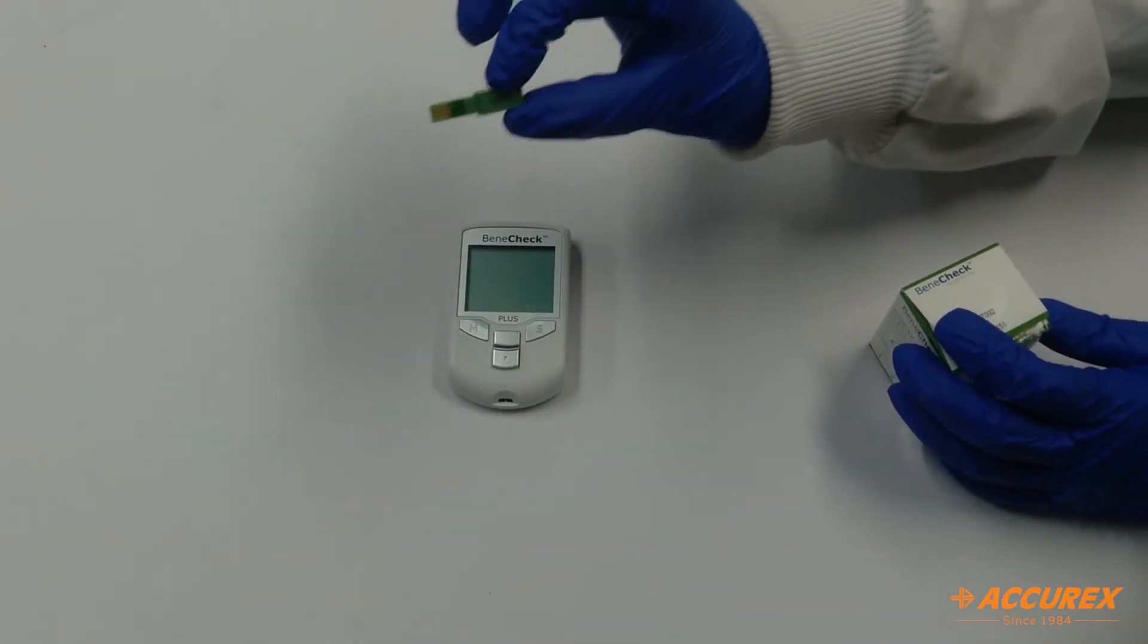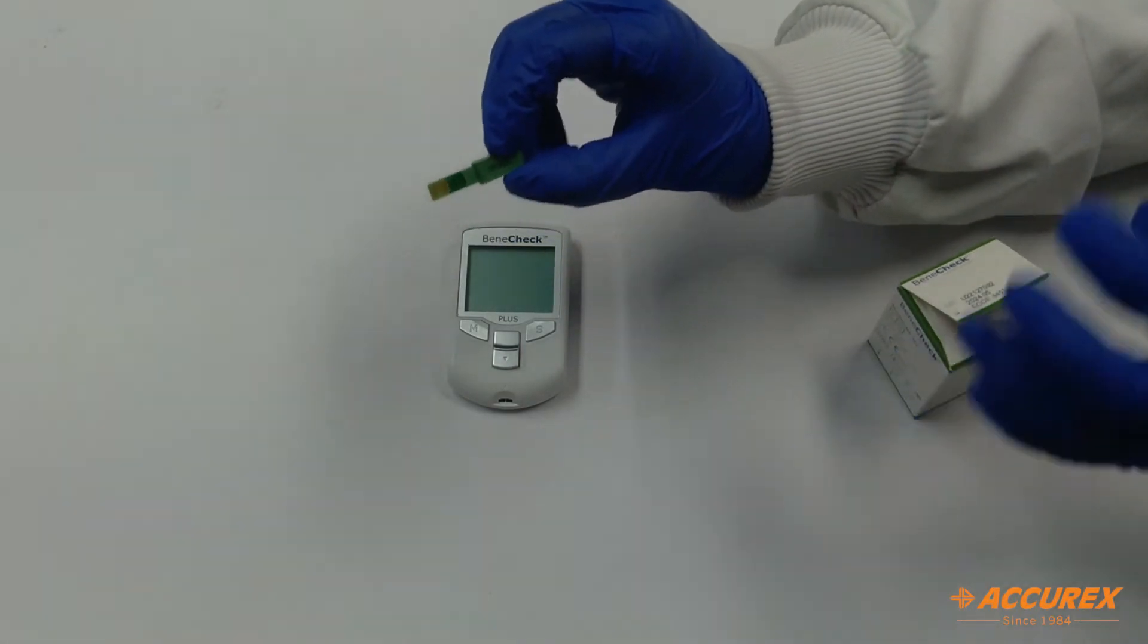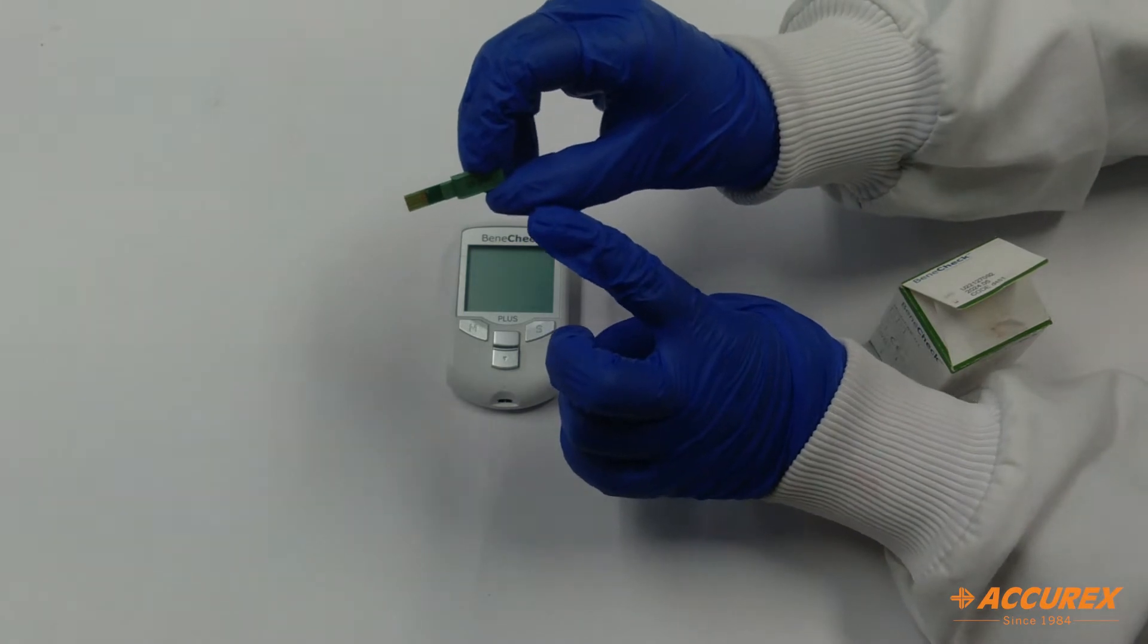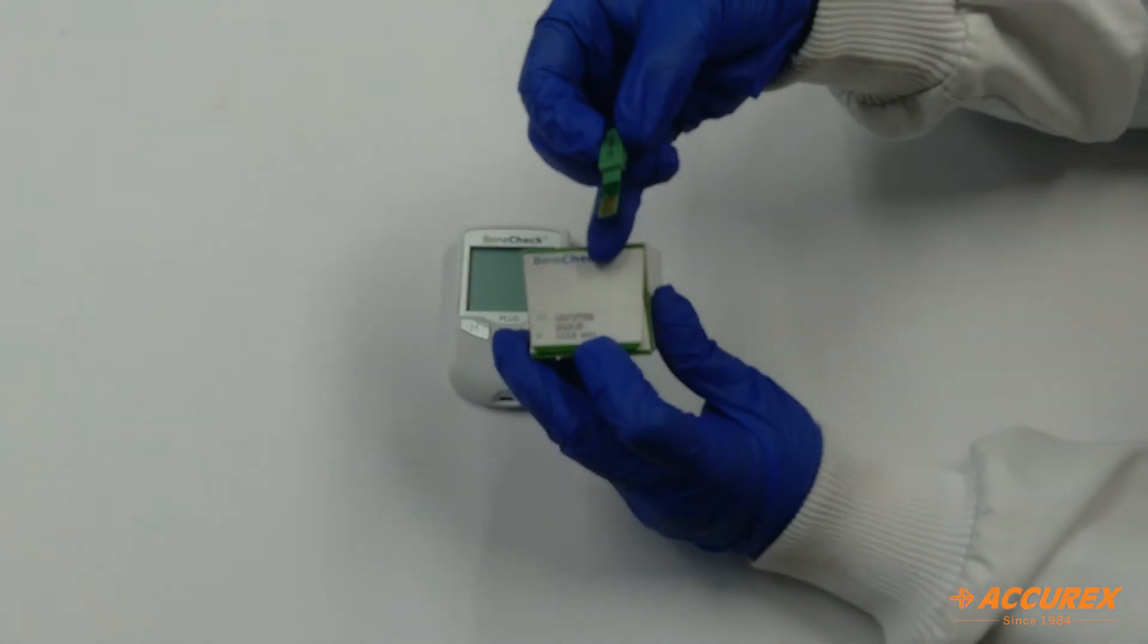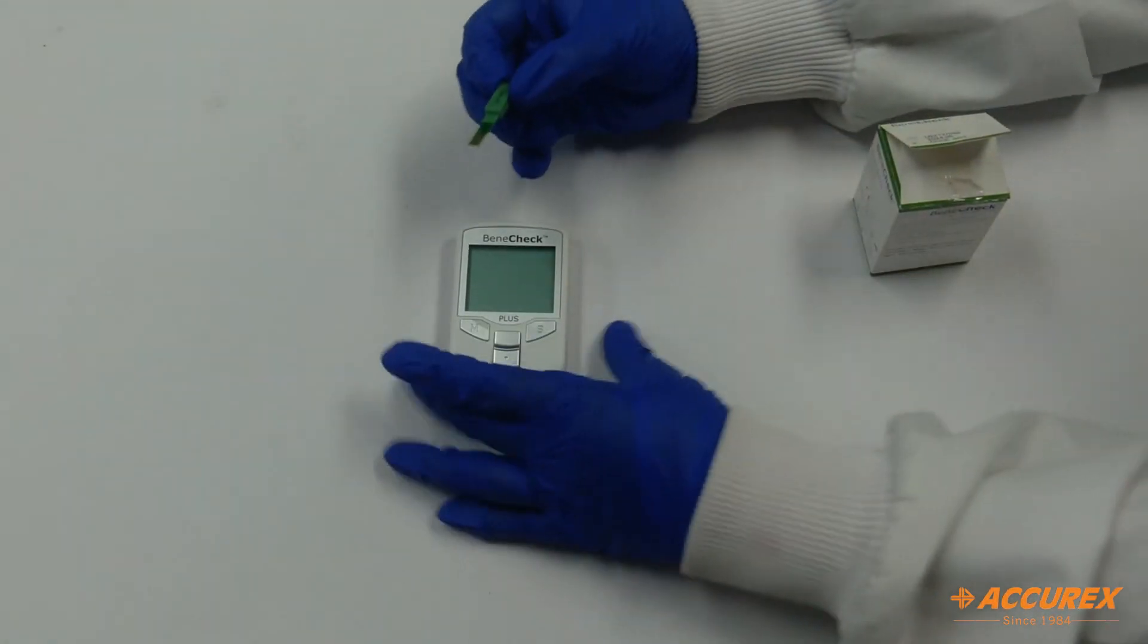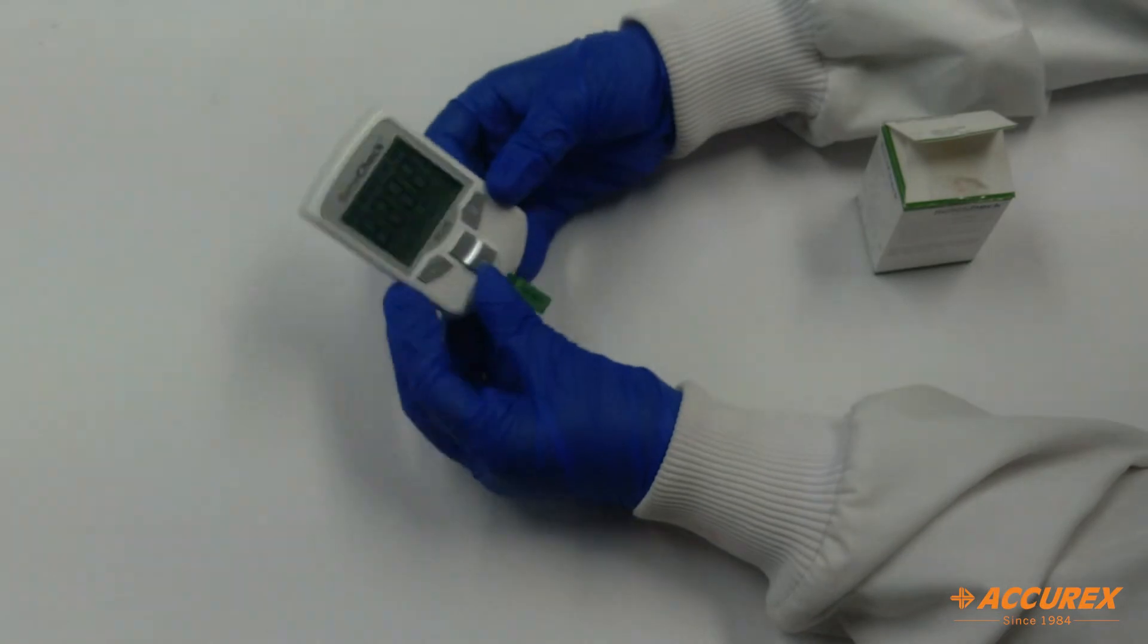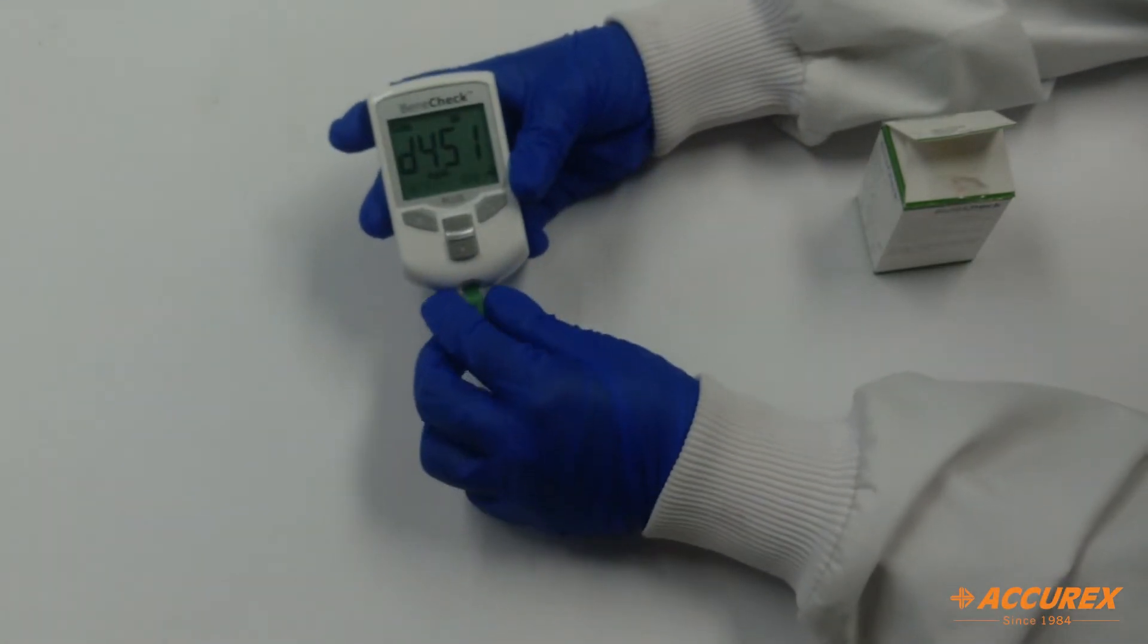First we need to insert this code chip. This code chip comes with the strips and the code number given over here, D451, should be equal to the code number given on this strip. For this code chip only this strip will work. We will insert the code chip in this meter like this and the code number will be shown over here and then we will remove it.